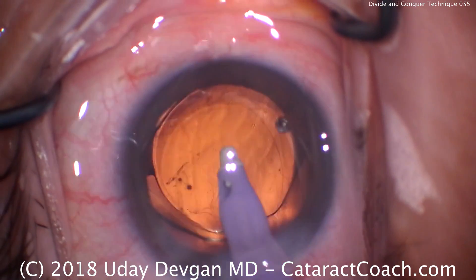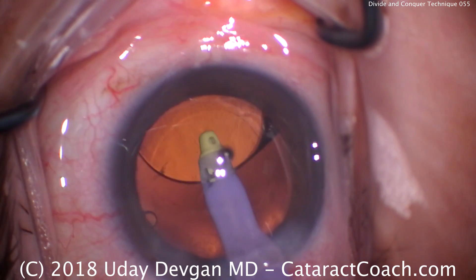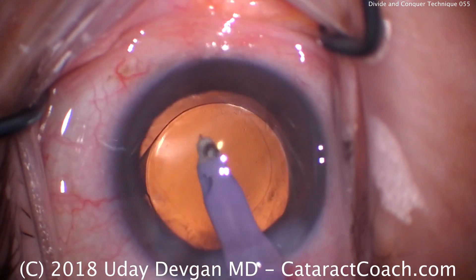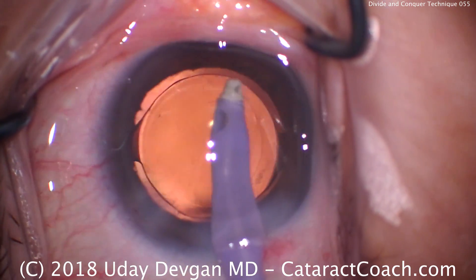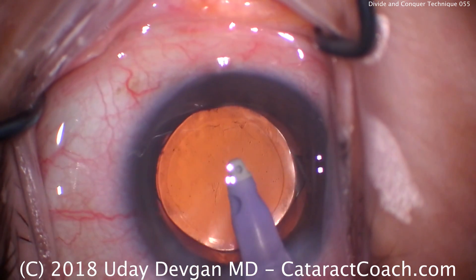Time to remove the viscoelastic. We'll get the IA probe in, go underneath the optic first, lift it up, remove that viscoelastic, then come in front of it and remove the remainder of the viscoelastic from the anterior chamber. We can confirm that the optic is completely overlapped by the rhexis for 360 degrees and the lens is well centered in the capsular bag.